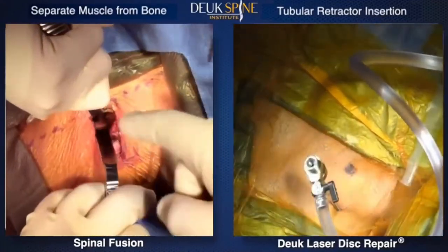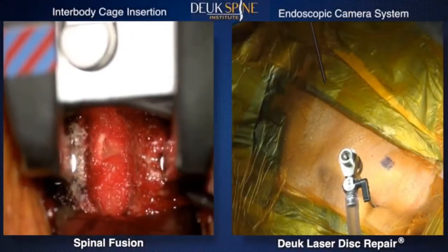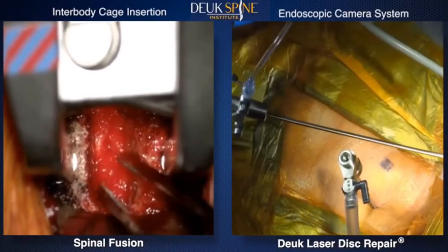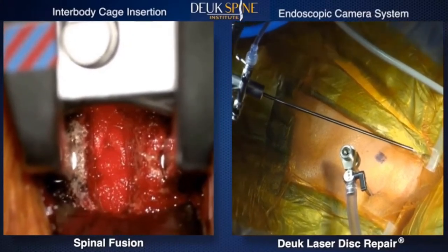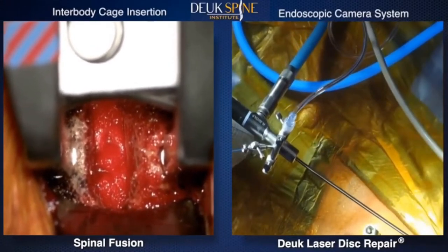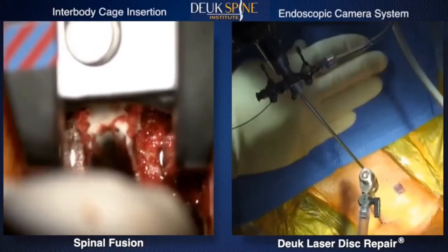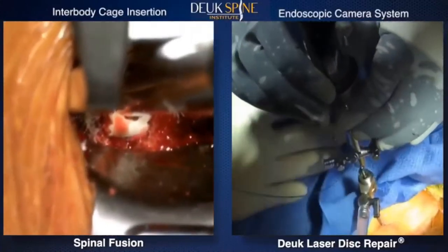To access the spine, spinal fusion requires the muscle to be separated from the vertebrae — a very invasive action causing permanent muscle damage. Whereas in the endoscopic Deuk Laser Disc Repair, the muscle is not damaged. The fiber optic laser is manipulated with great accuracy to remove only painful inflammatory tissue from the disc, precisely debriding — essentially vaporizing — damaged tissue in the disc's outer layer, the annulus, specifically at the annular tear, which is the source of the rupture, herniation, and pain.